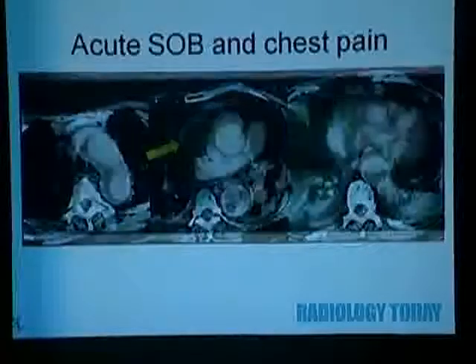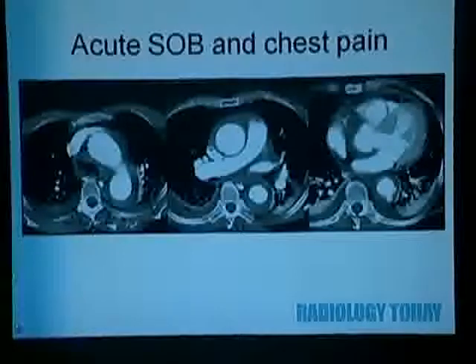Okay? Now, what everyone thinks of as the dissection protocol is the post-contrast imaging, where we're looking for the dissection flap and all that. This person had no dissection flap, but they did have that intramural density, which was intramural hematoma. Now, that's very significant because those are treated similarly to a dissection. And we've seen that. I think in this last month, I've seen at least 3 cases of this. So this is a type A involving the ascending and descending. This is an aortic intramural hematoma.